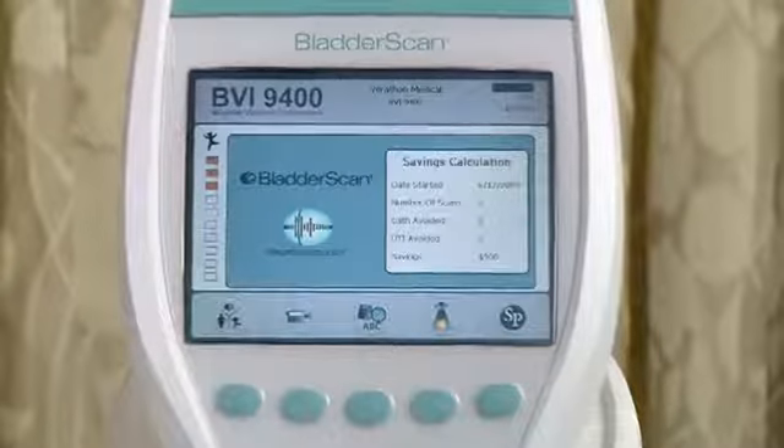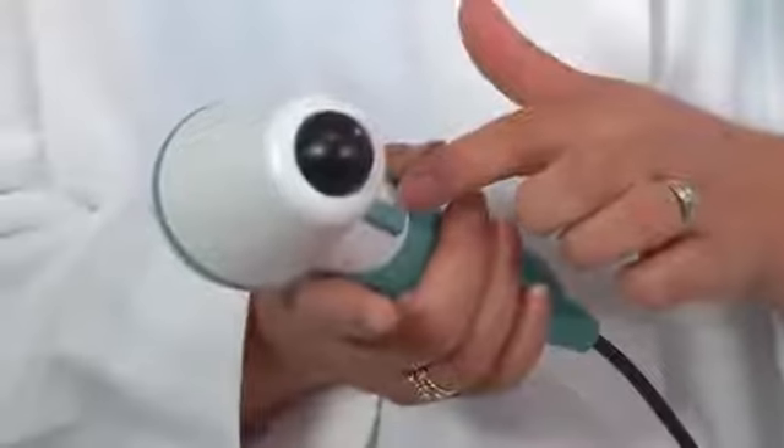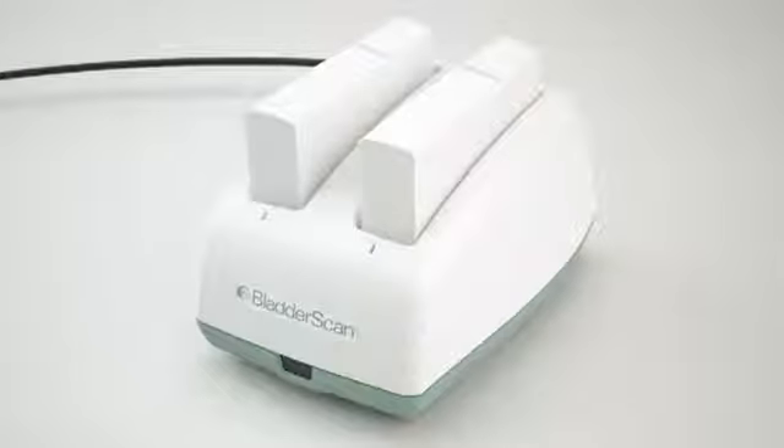The Bladder Scan BVI9400 is a battery-operated portable instrument that has a color display console. It also has an ultrasound probe that scans the patient's bladder and needs to be wiped with alcohol between patients. This is the button that is pressed to perform the scan. The Bladder Scan has a combination battery, charger, and wireless hub. It comes with a manual and I recommend you review it before you use the device.